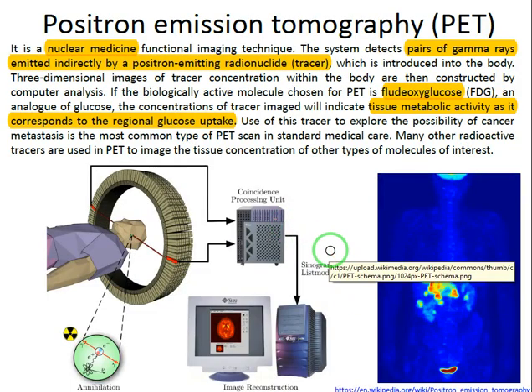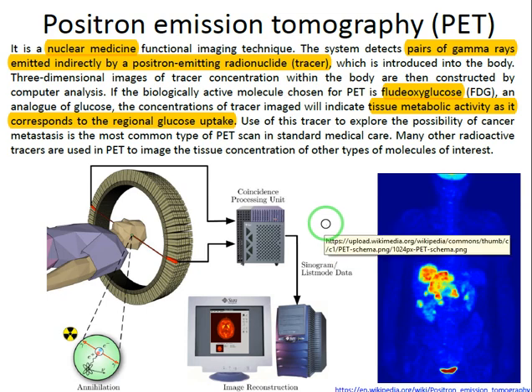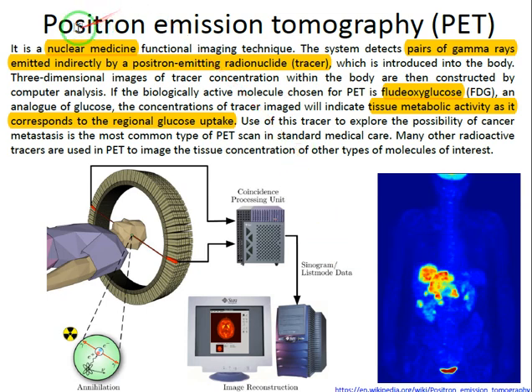But now let's go into a new imaging technique which is highly used for cancer therapy, and it is somehow a little bit complicated. This technique uses positron emission tomography, known as PET. Well, it uses radioactive materials as the imaging modality, as the tracer to send the signals towards our detector.